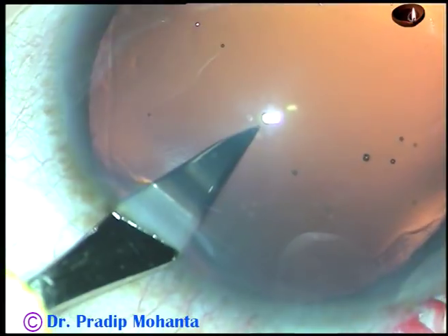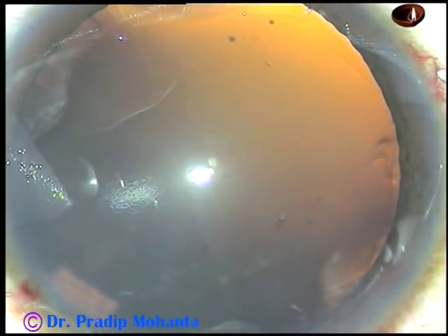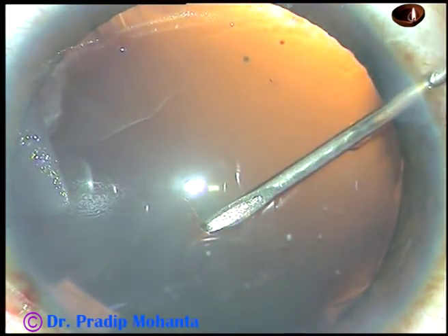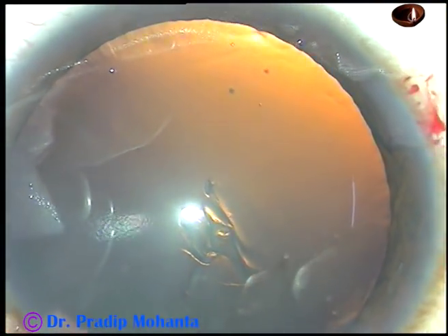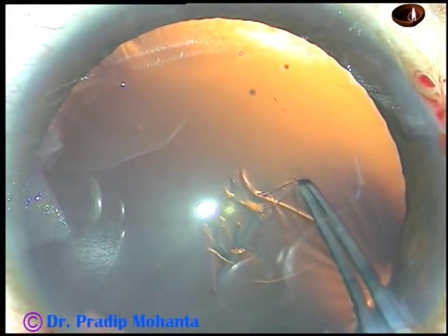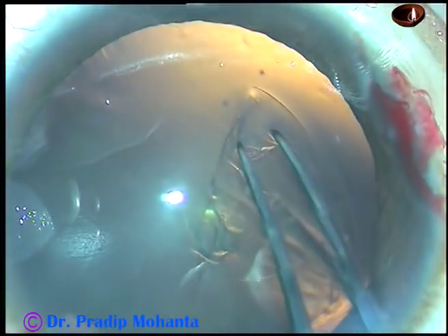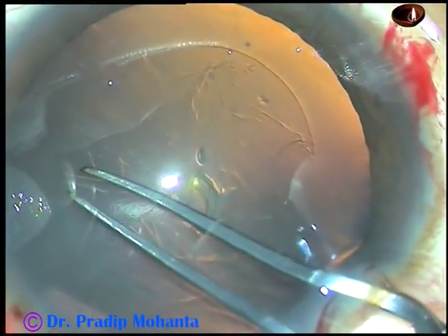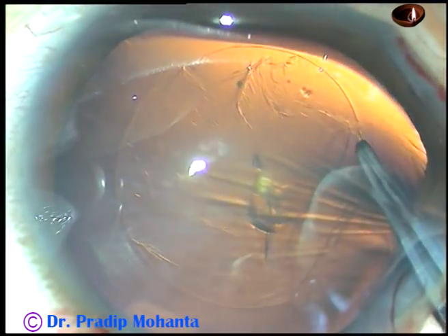I planned cortical cleanup by bimanual irrigation aspiration. Now, capsulorrhexis. The capsule has been incised and a nice, easy-to-hold flap has been raised. See the rhexis with Utrata forceps — hold this capsular tag, go anti-clockwise, remain at a certain equal distance from the margin of the dilated pupil and do a nice round rhexis.